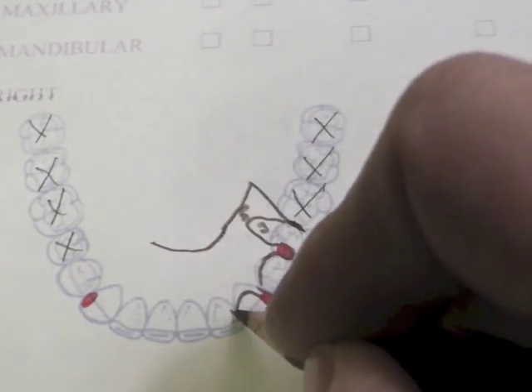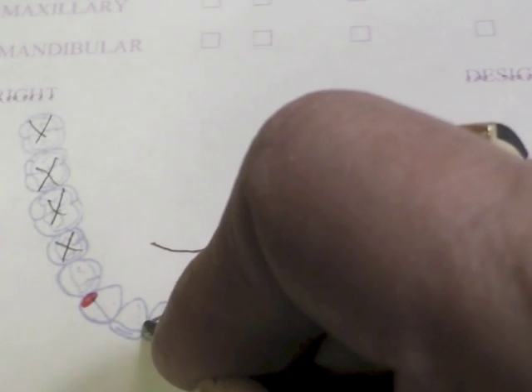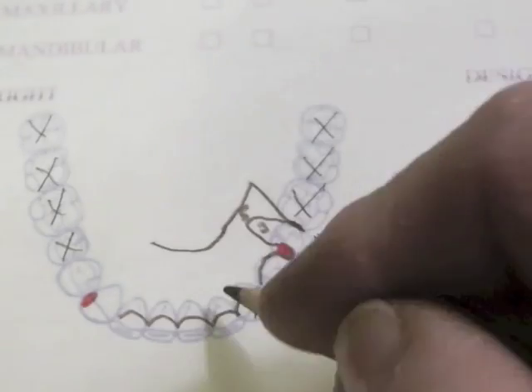We will do a lingual plate. It comes up, going from contact point to contact point, but does cover the cingulums of the teeth — never at the gingival margin. So this is our indirect retainer right here.